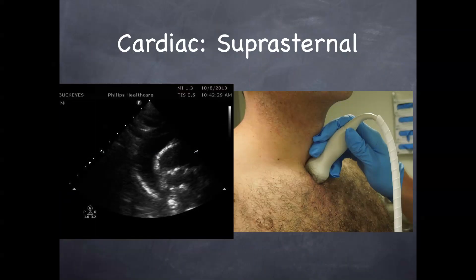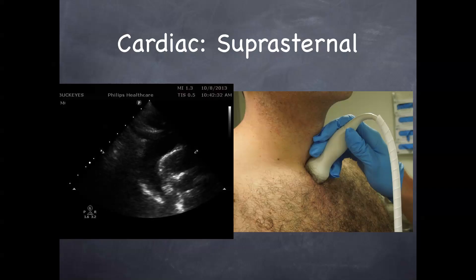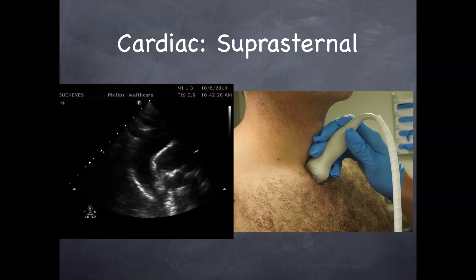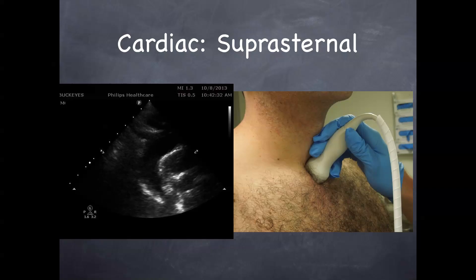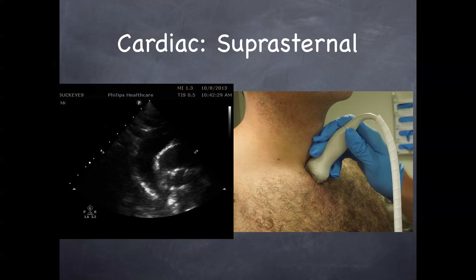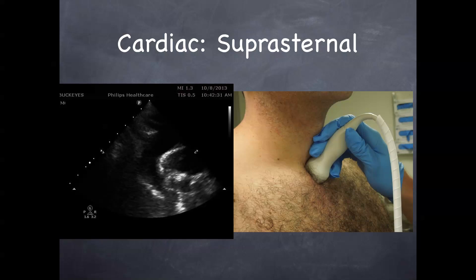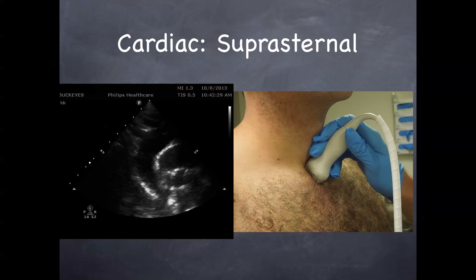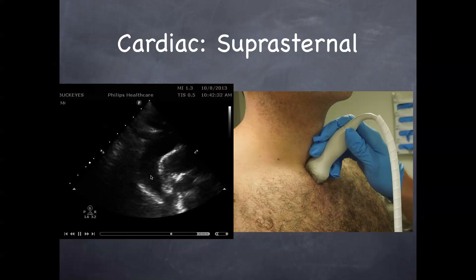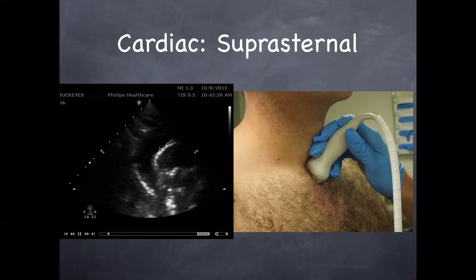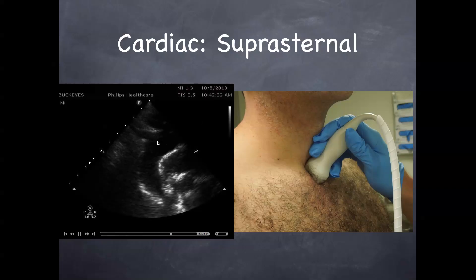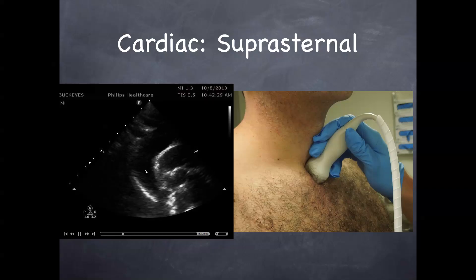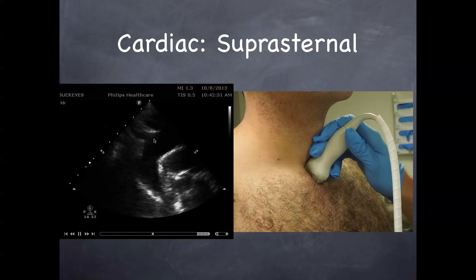Here's a suprasternal view. You do this view if you're concerned about a dissection — if you see a large aortic root, if the patient has ripping chest pain and unstable or unequal pulses. Just stick your phased array probe above the suprasternal notch and look downward at the aortic arch. This is your aortic arch here with a dissection — you can see a nice flap in the middle of this arch.